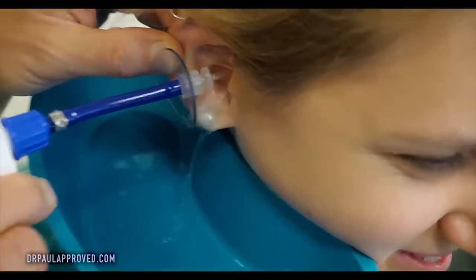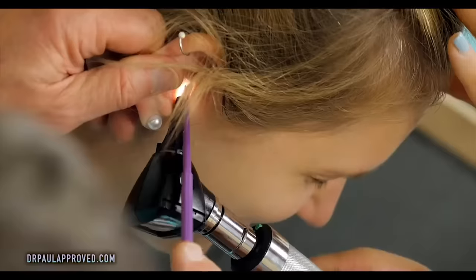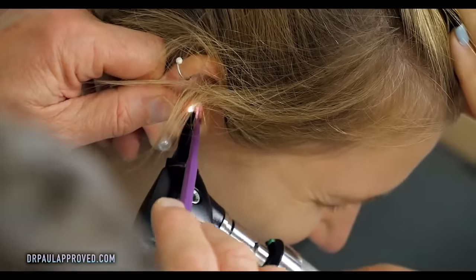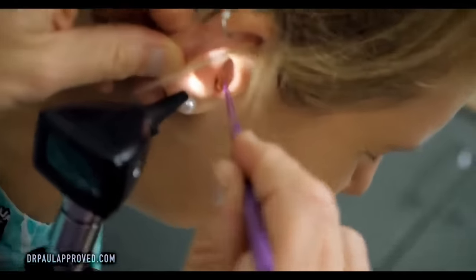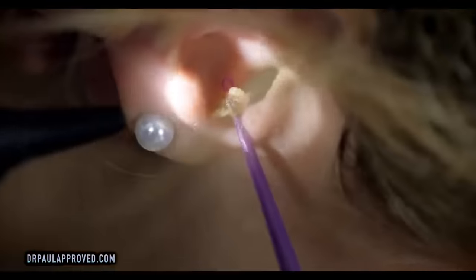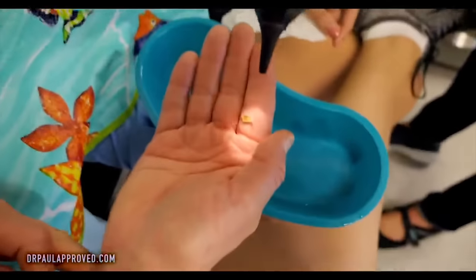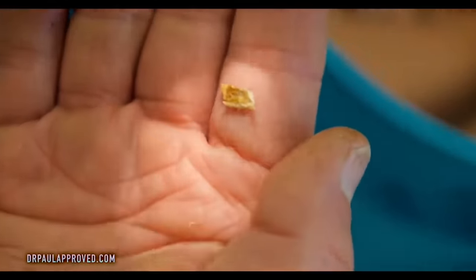I didn't really do that — you're in there way deeper than you are. The purple one. You're in there. Look at that baby. That's a beauty. Oh, it fell. Oh, look at that. That's great. Oh, you're going to get so much grief for putting that in your hand. That's why I did it. Okay, looks like wax.